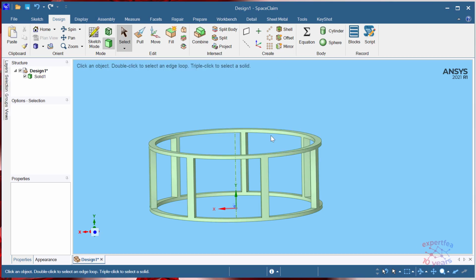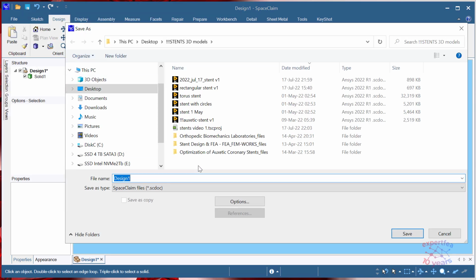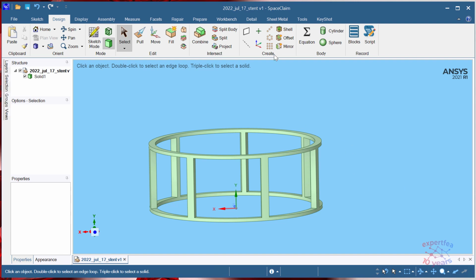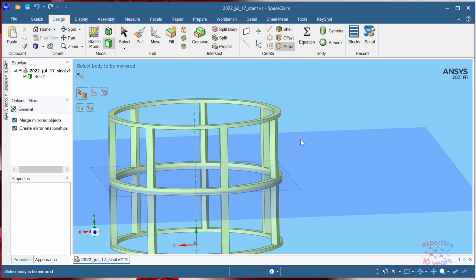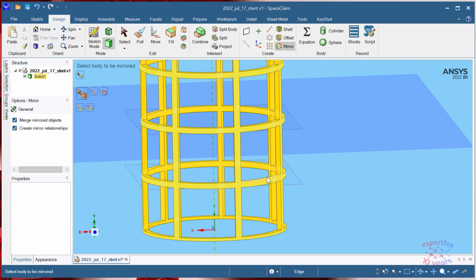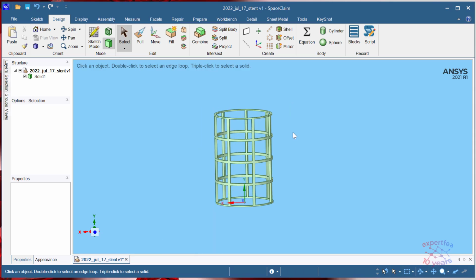Let's, there are many ways to multiply this portion. Let's firstly save this. Let me replace this. Okay. One of the options is select mirror plane, and this is the body to be created. I can also mirror again. I will select this face and mirror this part, and I have 1, 2, 3, 4 instances multiplied by 2 millimeter.